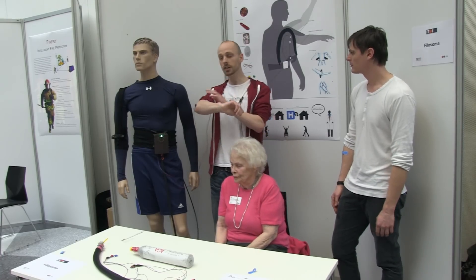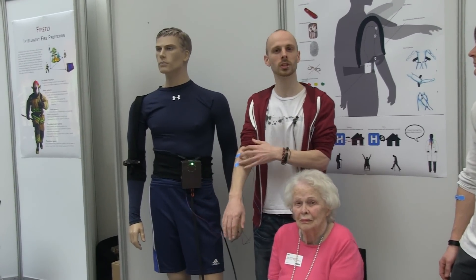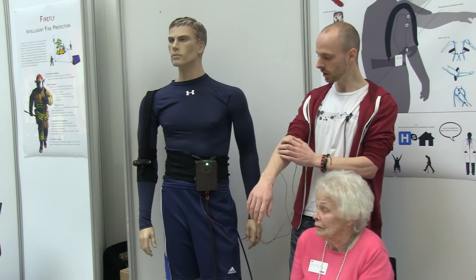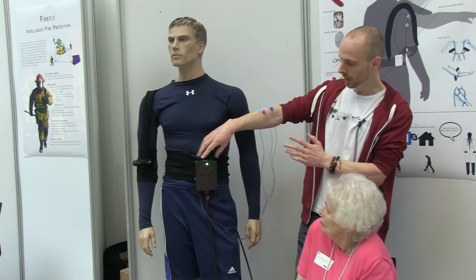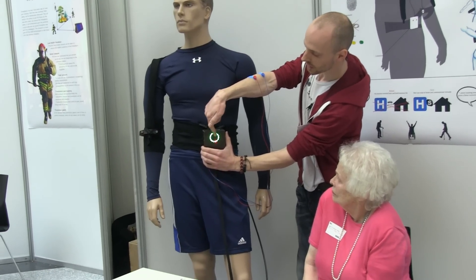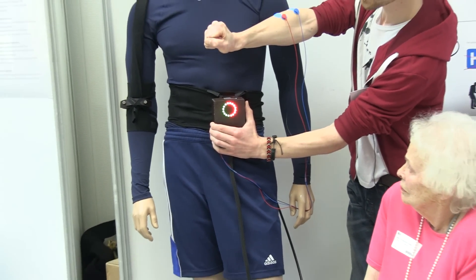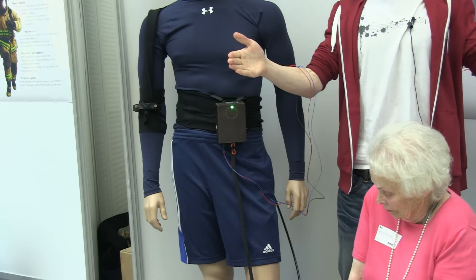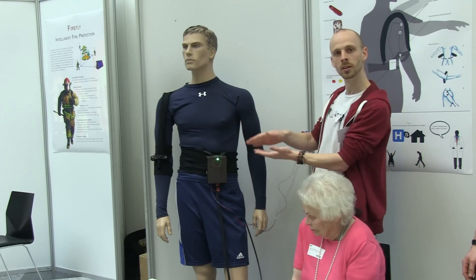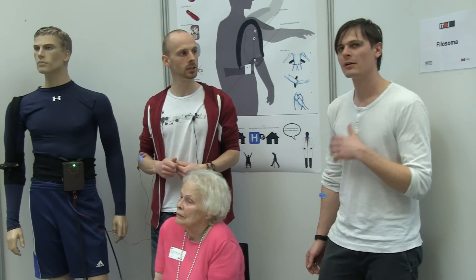Another point is that EMG electrodes are not completely absolute in value — it depends on where you put them, what type of muscle you put them on, how strong the muscle is. So we made a calibration process. When you put it on and turn on the system, it's initially red asking for calibration. If you press this button you see your current value, and if you tighten the muscle you see the range where you go. Then you release the calibration and it spreads out the operation range. So your maximum actuation is within the range you can actually do — even a weak person with very weak muscle activity could use this.